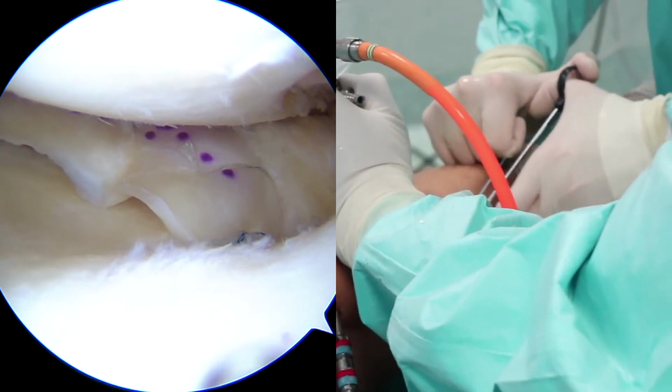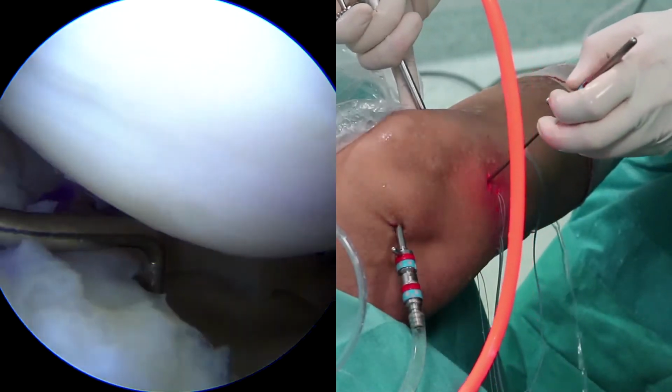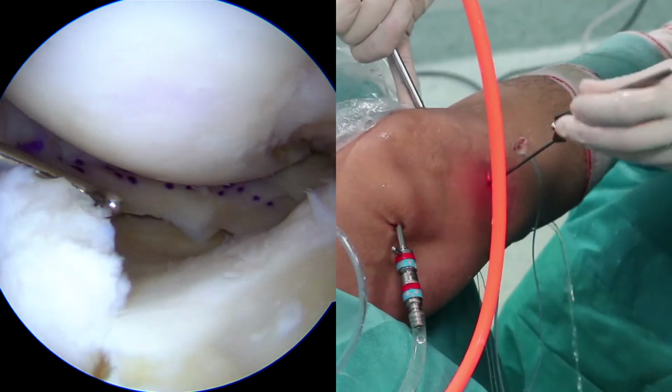Finally, the sutures from the anterior and posterior horn are sutured to each other at 30 degrees of knee flexion with valgus, leaving both meniscus horns anchored and completing the transplant.